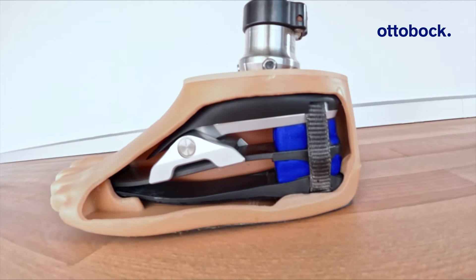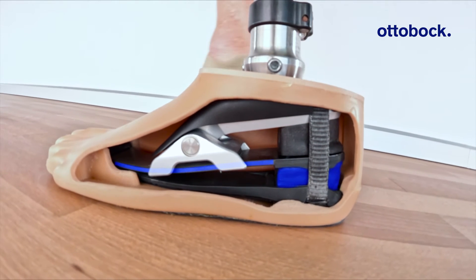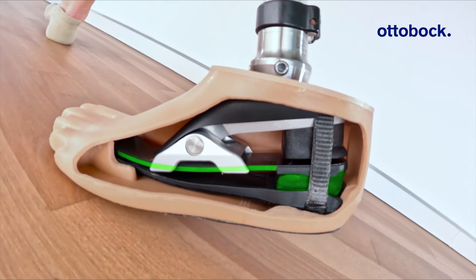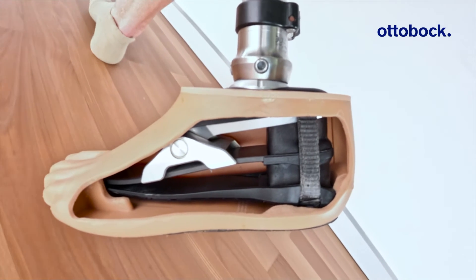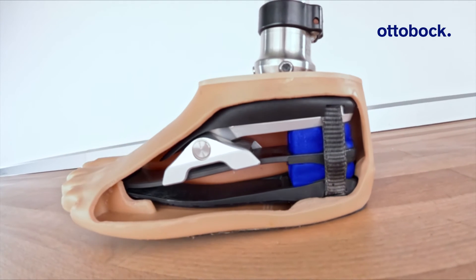Now the lower wedge is further compressed and takes up more energy. The carbon spring and ankle joint smoothly engage to energetically transition the user forward. The stored energy is returned through the forefoot to enable a smooth entry to swing phase.